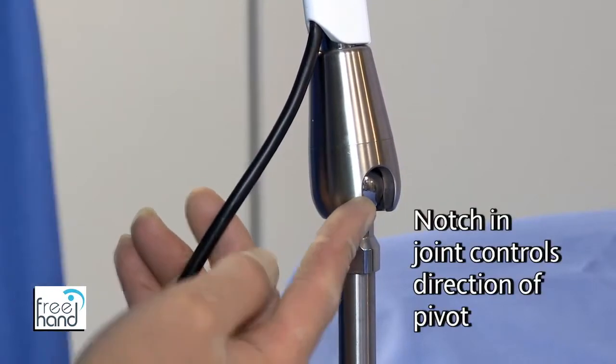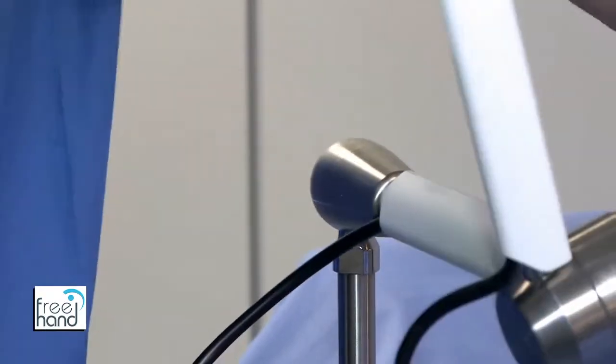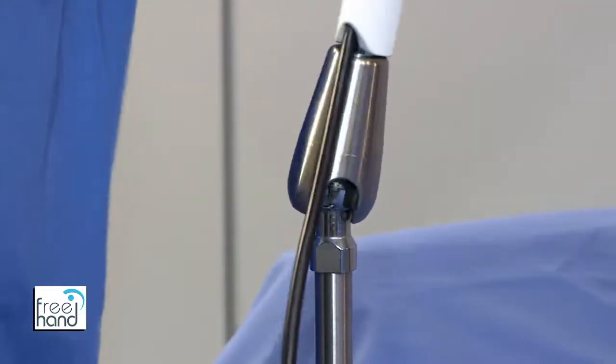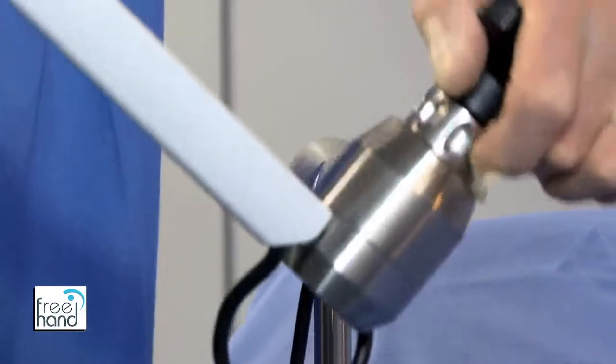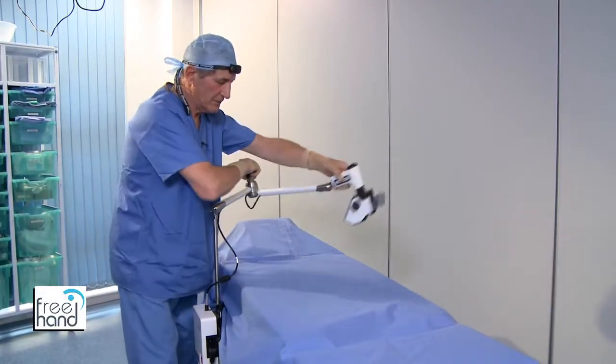Shoulder joint, which allows the arm to pivot in the direction of the notch. It will not pivot in the opposite direction. Once you've found the notch, then you're able to move the arm in any direction that you require.